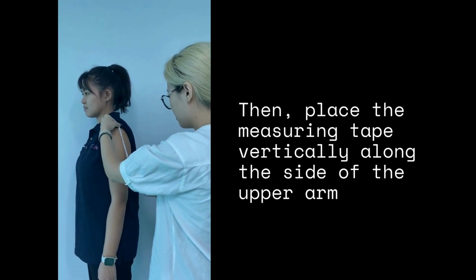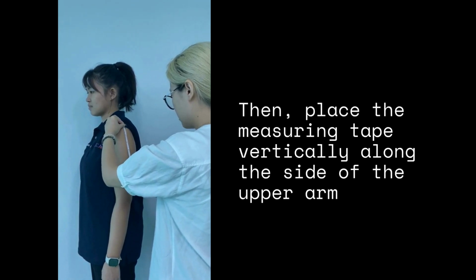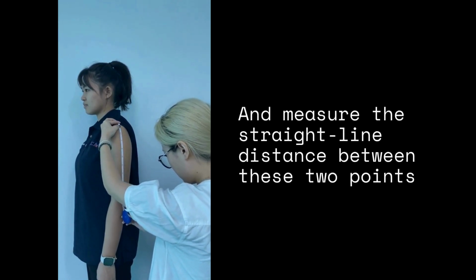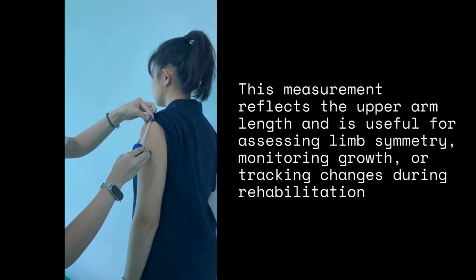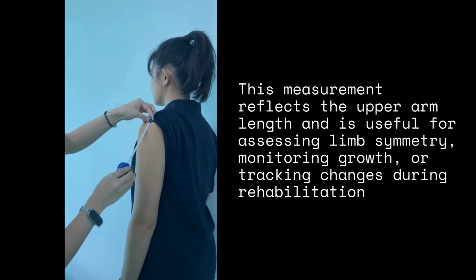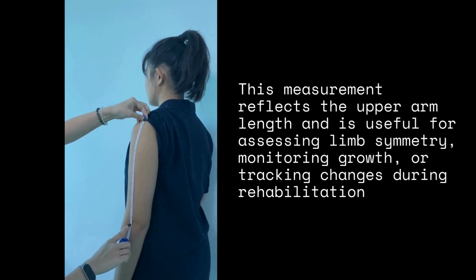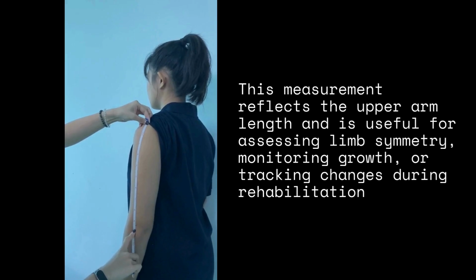Then, place the measuring tape vertically along the side of the upper arm and measure the straight line distance between these two points. This measurement reflects the upper arm length and is useful for assessing limb symmetry, monitoring growth, or tracking changes during rehabilitation.